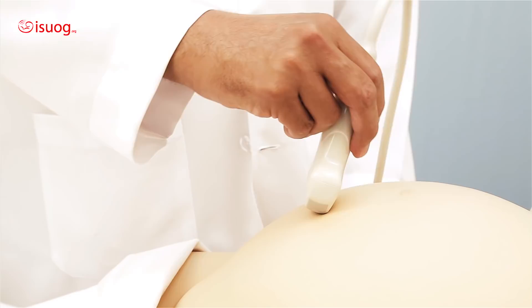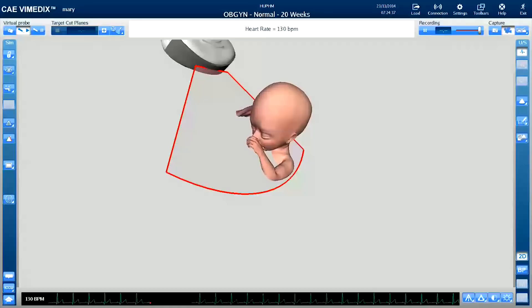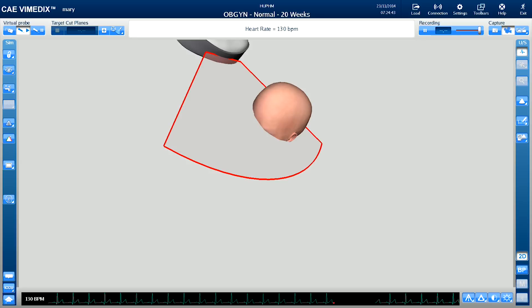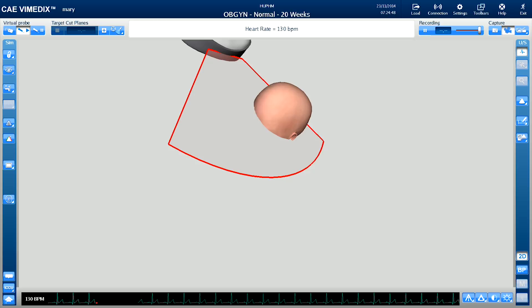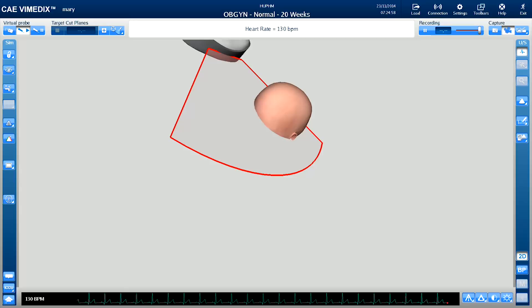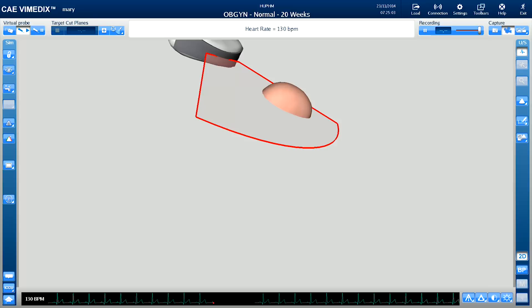To demonstrate angling, I'll use the example of trying to obtain a biparietal diameter in a breech fetus. As you can see, I am moving my probe on the broad to obtain a biparietal diameter, but I am cutting the head in an oblique plane — I am unable to obtain the trans-thalamic plane. In order to correct this, I will angle. As I angle, I am getting a higher plane, so I need to slide on the broad. And now I am cutting the head equally at the biparietal diameter.